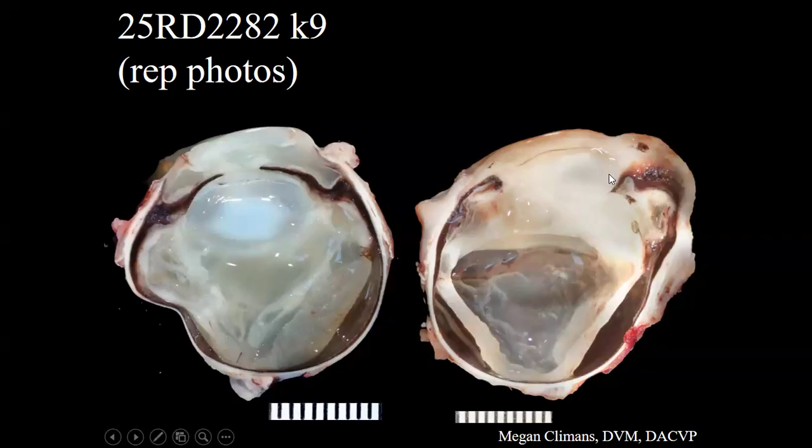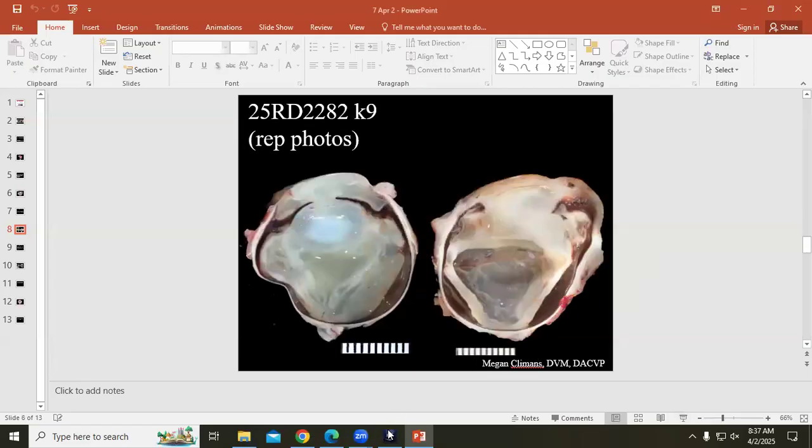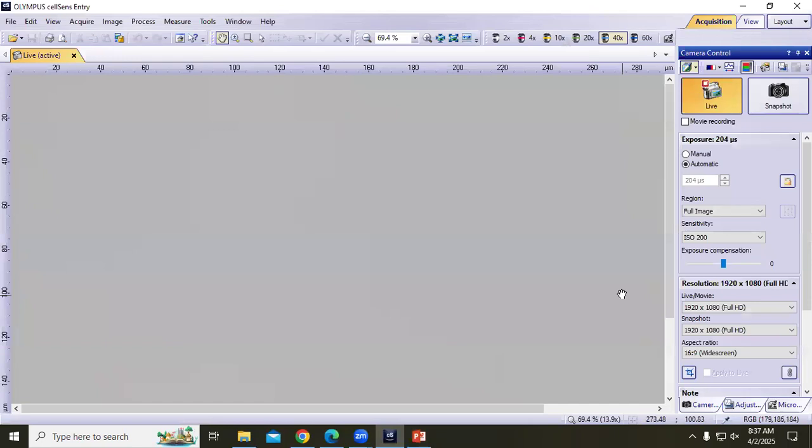There's this carpeting of the uveal surfaces, especially visible anteriorly. The additional thing that this one has that's like our case that I thought was interesting is this bulge at the limbus, where you can't really make out an obvious sclera. There's maybe something weird going on here. And our case also had a limbal bulge like that. So let's go to histology.